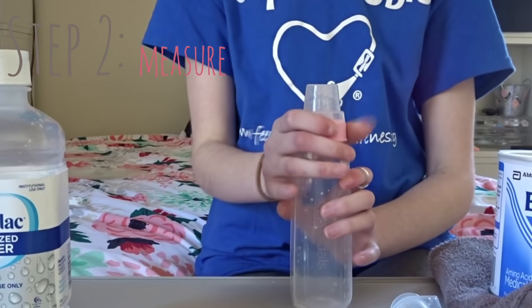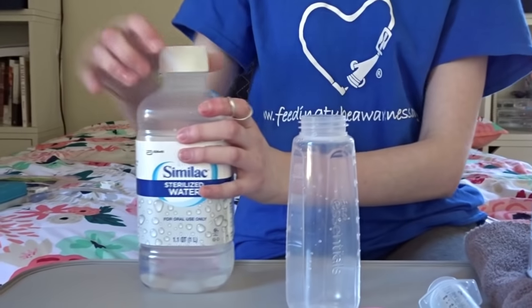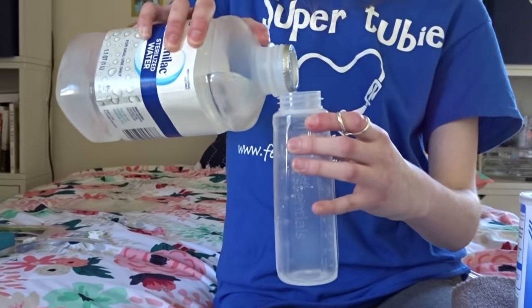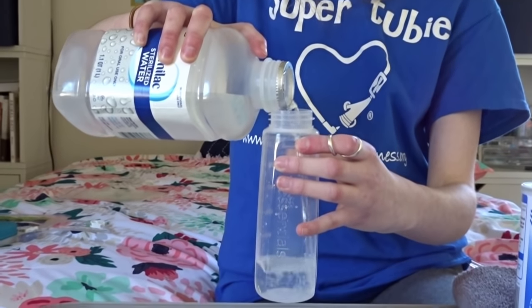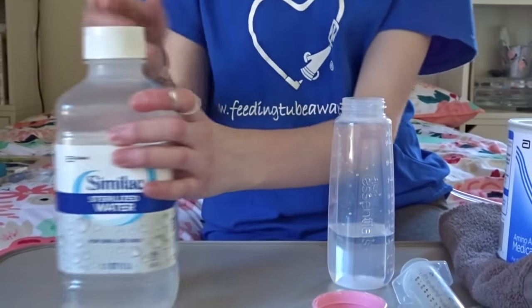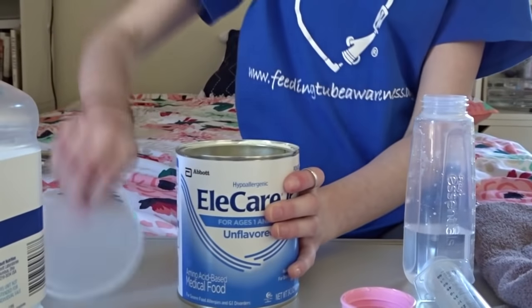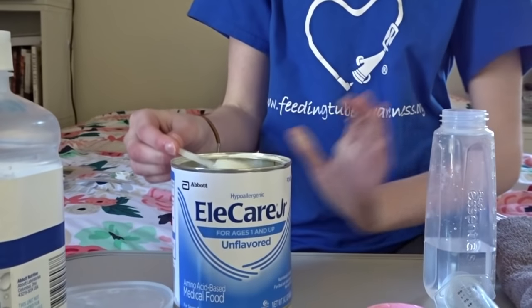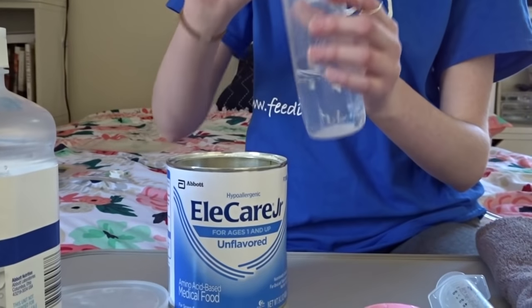Step 2 is measuring your water to put the formula in. I do one scoop per every 20 ml of water, so I'm going to pour 100 ml here, and that is going to require 5 scoops of Ella Care Jr. This is not the recommended concentration mixture, but because I need more calories and I run at a slow rate, that is what my doctors told me to do.